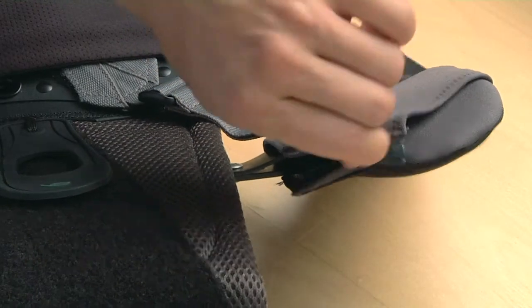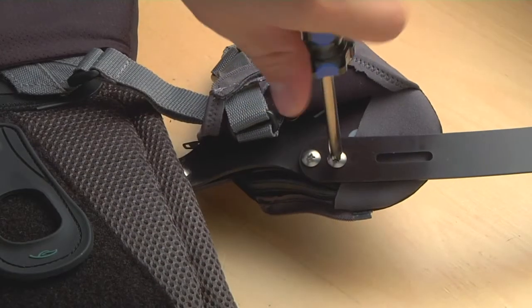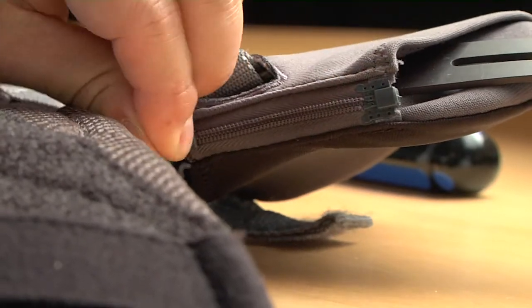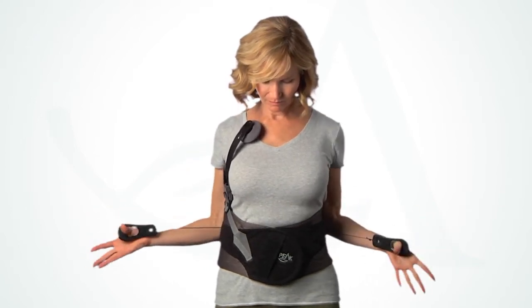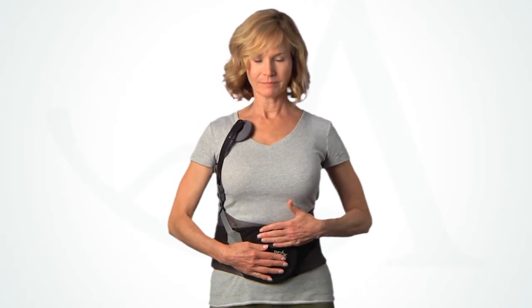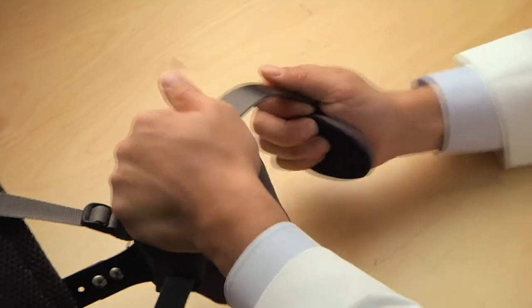Unzip the thoracic pad sleeve to expose the two points where the chest strut will attach. Use the two screws provided to attach the chest strut. Once in place, zip the thoracic sleeve closed. Have the patient reapply the brace. The chest pad should land approximately one inch below the clavicle. If needed, the strut can be easily bent to achieve a perfect fit.